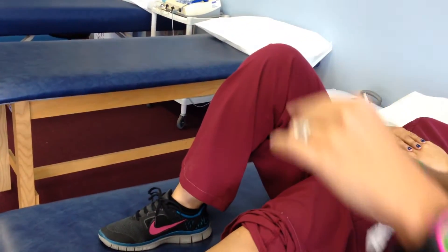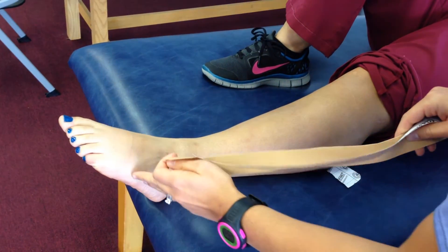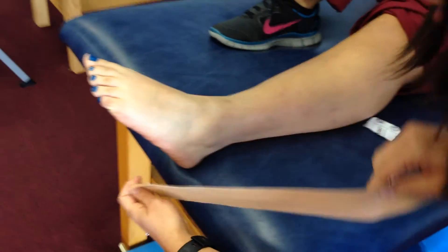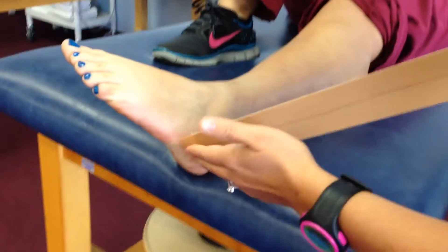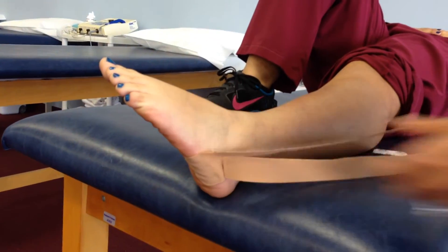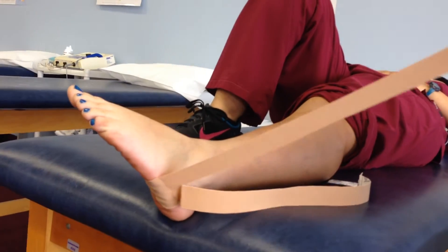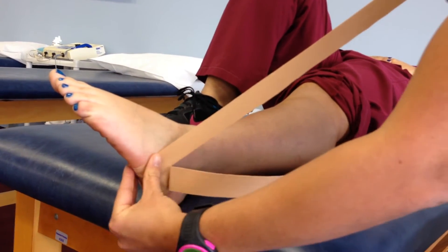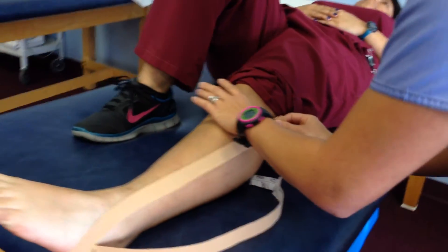You're going to have the patient plantar flex and invert in their pain-free range of motion. You're going to anchor at the calcaneal cuboid area, then tear that piece of tape off and just follow that muscle belly up to the proximal fibular head.